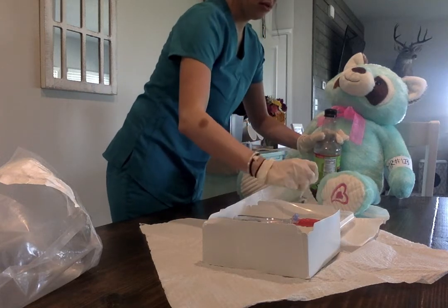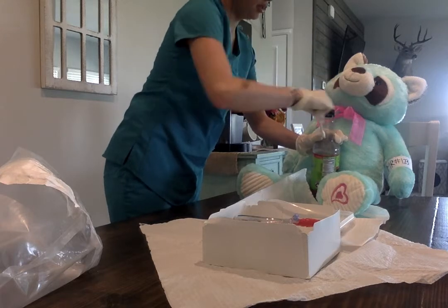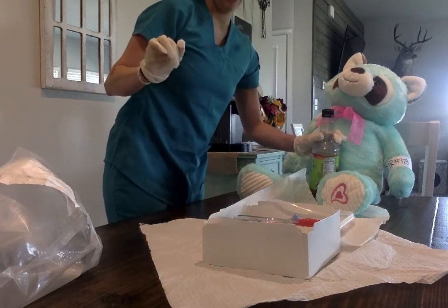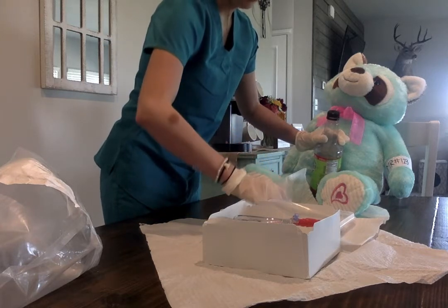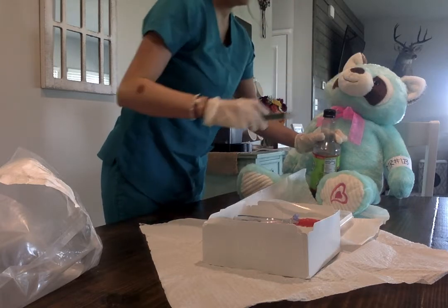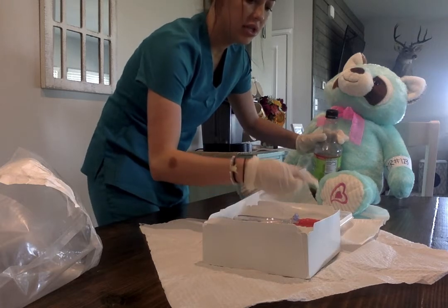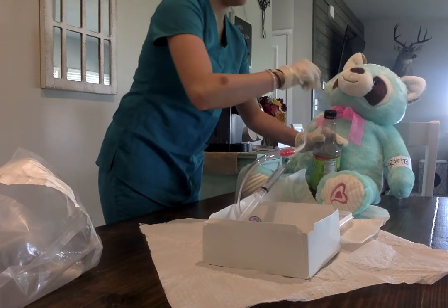Clean. Throw that away. Top. All the way down to the bottom, one more time, not crossing the sterile field, and throwing that away. Now I'm going to insert 5 mLs of lube, making sure to hold that at a 90-degree angle, holding it about 1 inch from the top. I'm going to insert the catheter.